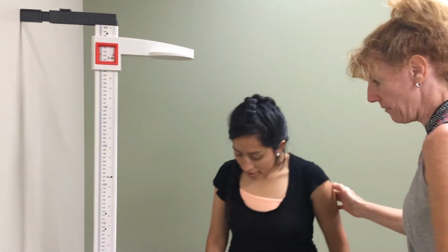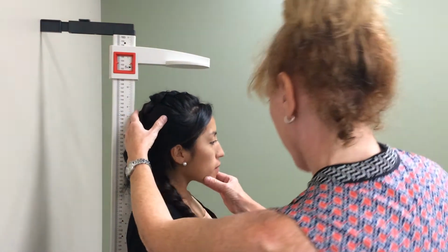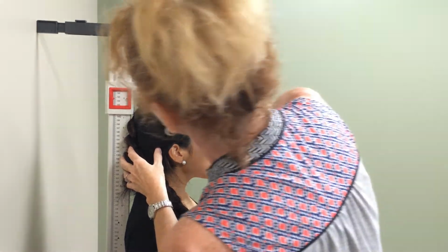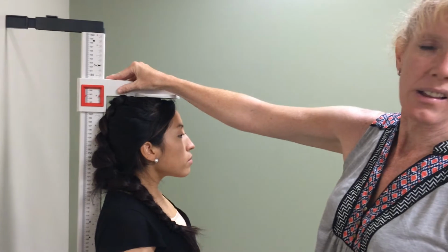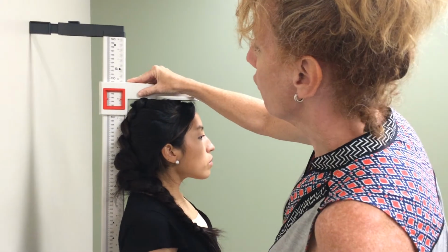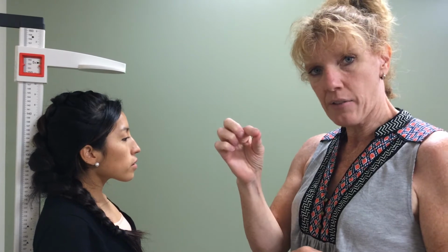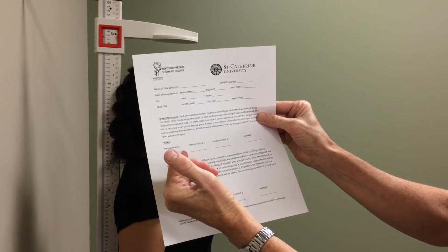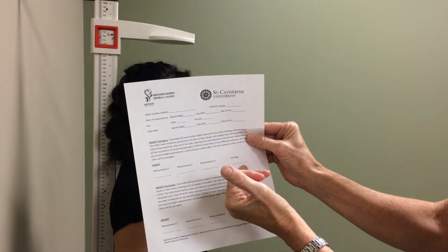Okay, now we're going to step back in. Make sure their heels are back. They're looking straight ahead. Slide it down. This time I would say it's 144.6, which is slightly different than 144.5. 144.5 and 144.6 are within 5 millimeters of each other, and so I would just take the average. So I'd write 144.5, 144.6, and then I would take the average and I would write the average here.